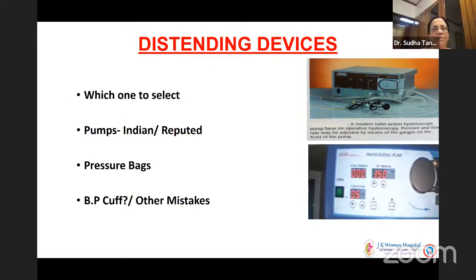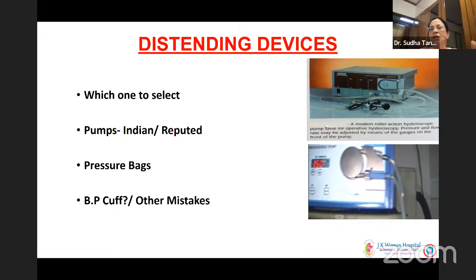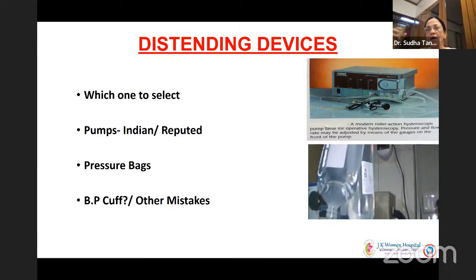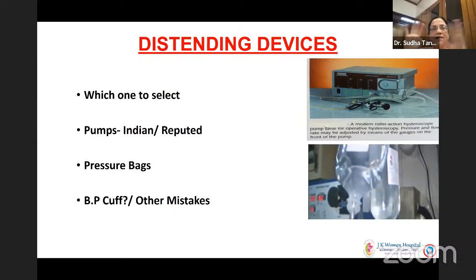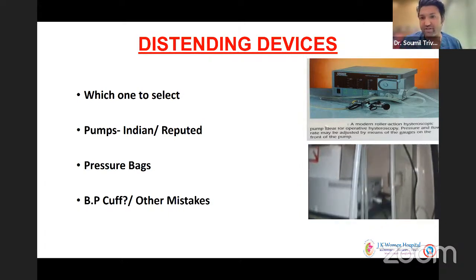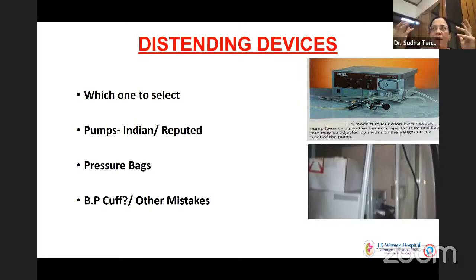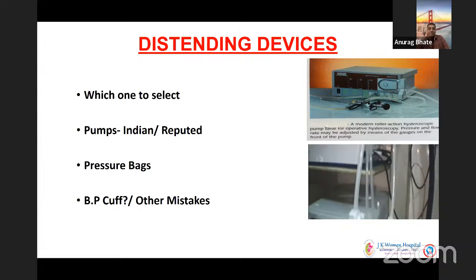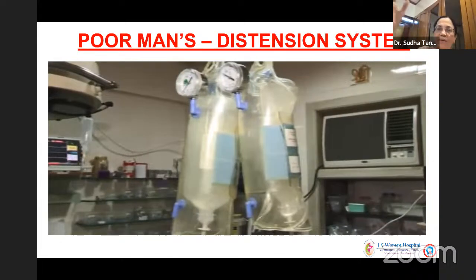Can I just make one statement here? Yes, please. We always talk of the right intrauterine pressure and the distension pressure, but when we are operating, there is so much leakage from the os. So what is the actual pressure at the point where you're operating? I think there is no device which will measure it. There are devices which measure effective intrauterine pressure, madam. But secondly, it has to be balanced. I think the pressure at which we get adequate distension to operate, that's it. That is what I was about to tell. There's no point keeping the pressure low and not being able to see the pathology.